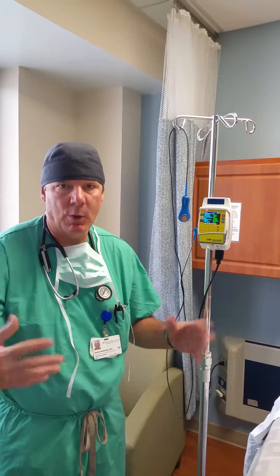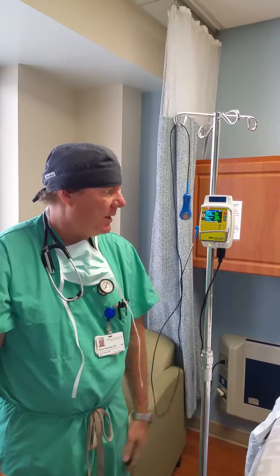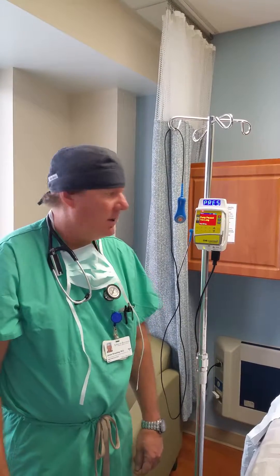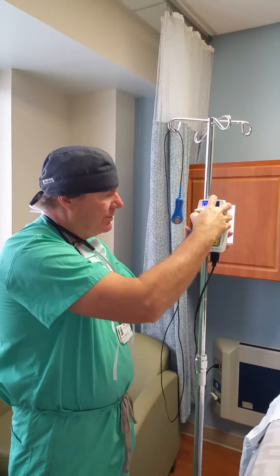If you have a really tall person, sometimes they require more. Usually around a five-foot person is where we start at 10cc an hour. At about 5'5", I usually go up to about 13. It paused too long, so we're just going to shut it off.